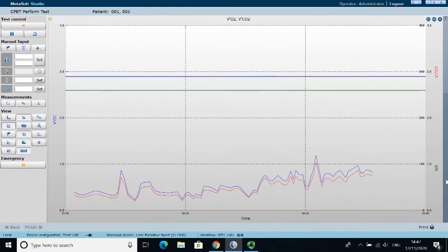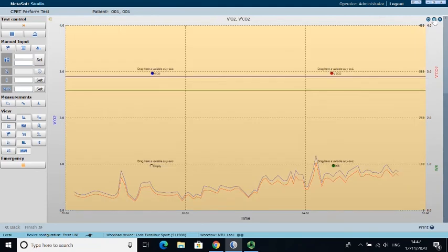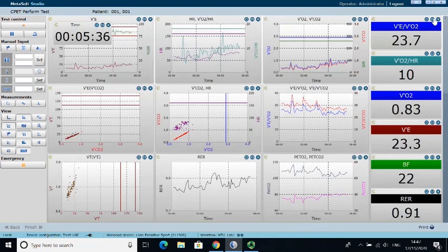Something also to note here, just getting through to the 6 minute mark, is to look at the relationship between oxygen consumption and CO2 output. You can see that one sits underneath the other, but essentially as one changes, the other one changes as well. And this is obviously because that's what's happening to the oxygen: you're turning most of it into CO2. So as we use oxygen, we're producing CO2 by a fairly equivalent amount. It's offset by a certain degree, but it's largely the same.